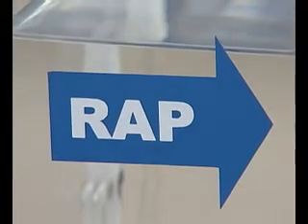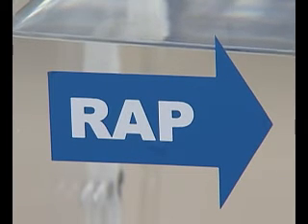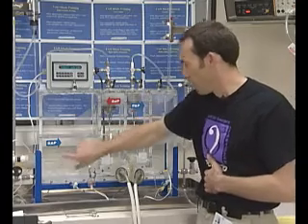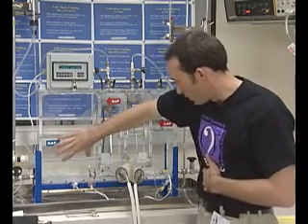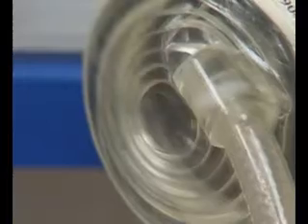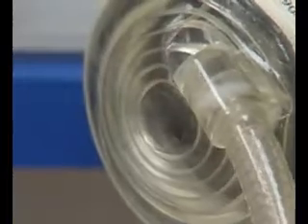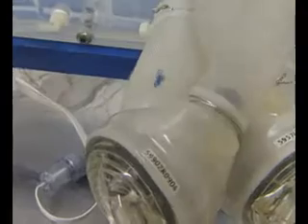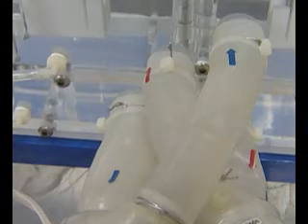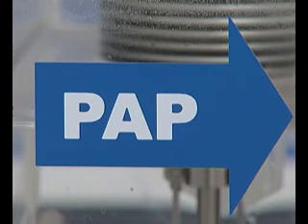atrial pressure. So the water level here gives us a pressure which is equal to a right atrial pressure that you would see in the human body. This reservoir then has an inflow that comes into the device. The device then pumps an outflow which goes out to the pulmonary artery, the PAP. This reservoir is a pressure which is equivalent to the body.